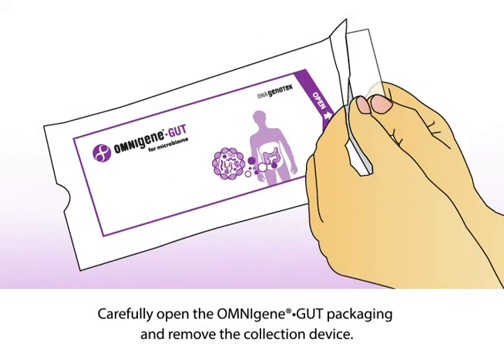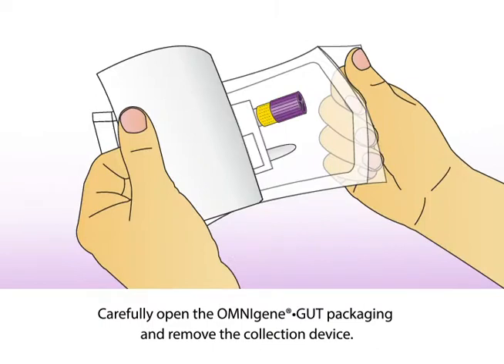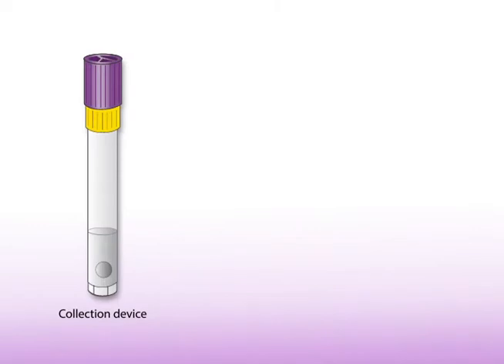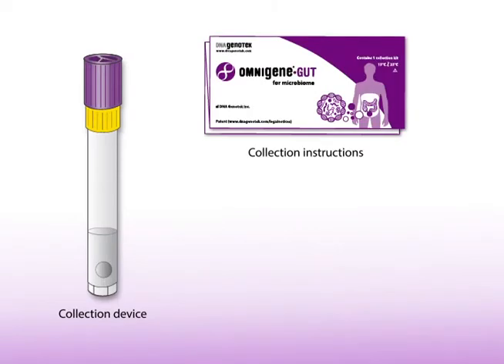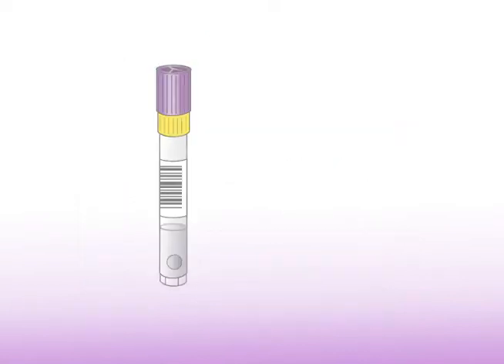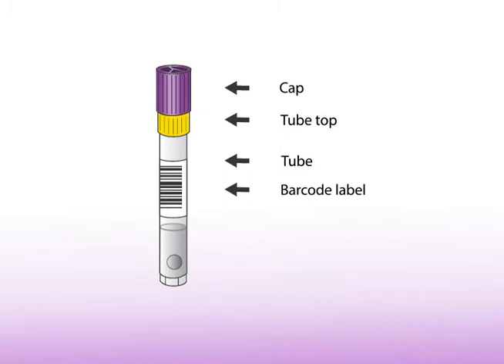Carefully open the Omnigene Gut packaging and remove the collection device. Contained within the packaging are: the collection device, the collection instructions, a spatula, and the OM-AC2 spoon accessory, which may be provided for the collection of liquid samples. The collection device consists of six parts: a purple cap, a yellow tube top, a tube, a barcode label, stabilizing liquid, and a mixing ball.